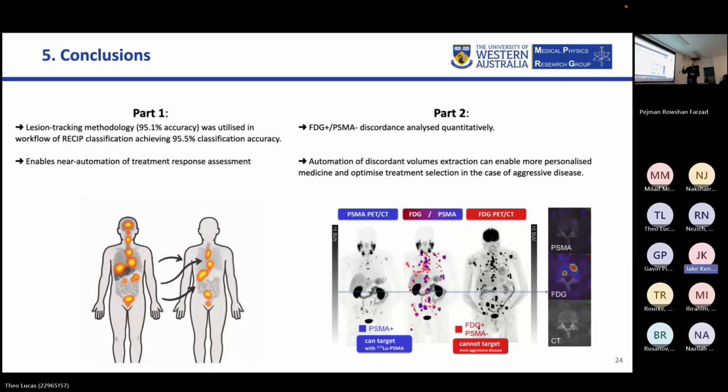It depends what dilation we use. As I experimented with the automatic dilation, it computes the distance from that lesion to every lesion surrounding it, and then applies a specific radius to it. So if all the lesions around it are really close to it, that dilation radius is actually going to be much smaller.